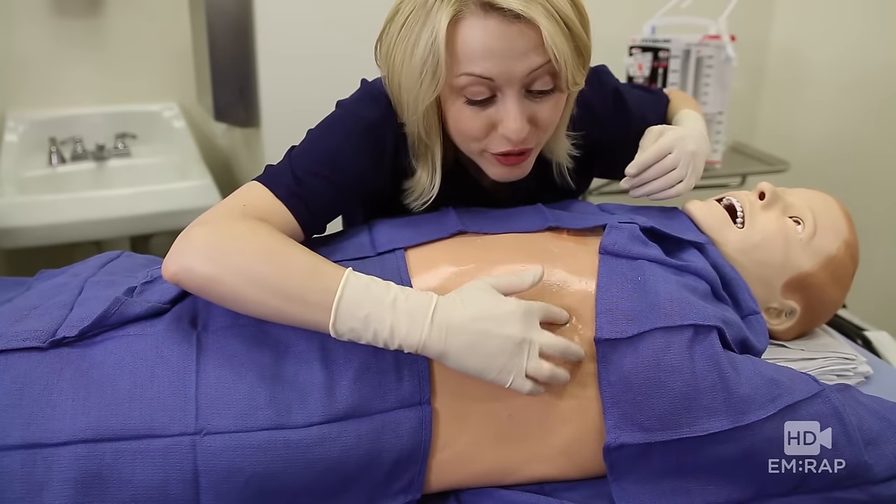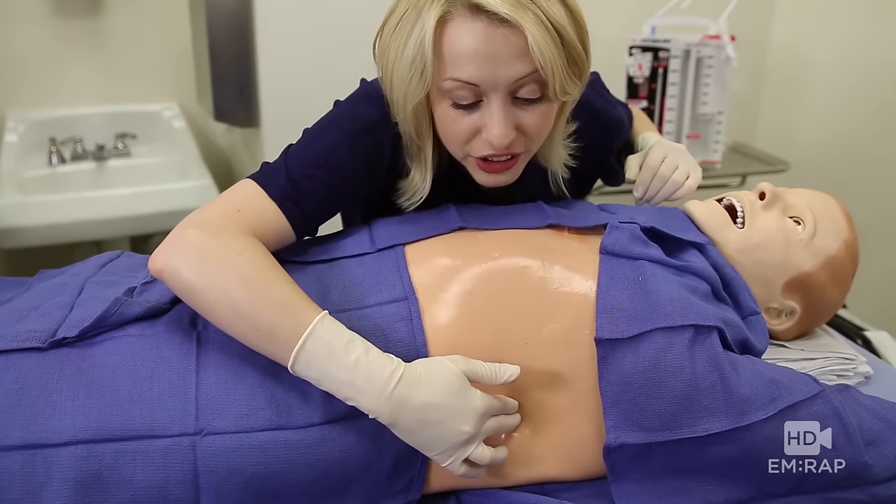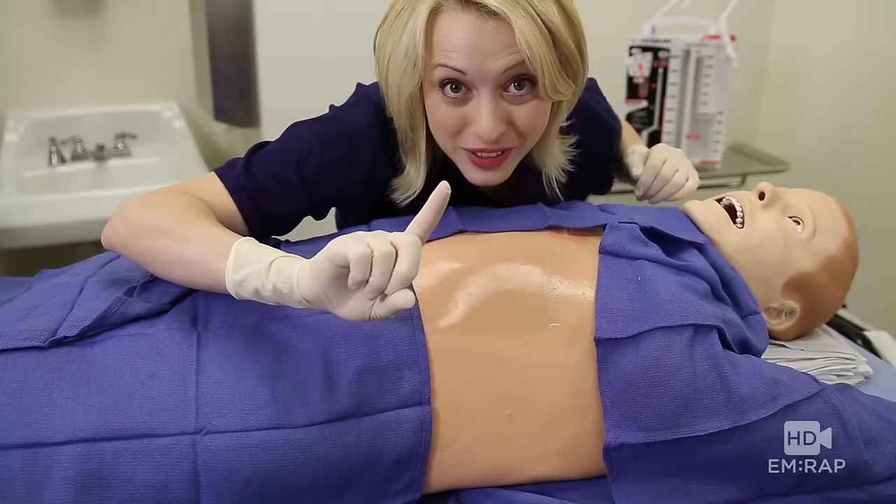Then you're going to palpate down to the fourth to fifth intercostal space in the anterior axillary line. That's the spot. Now let's go get our equipment set.